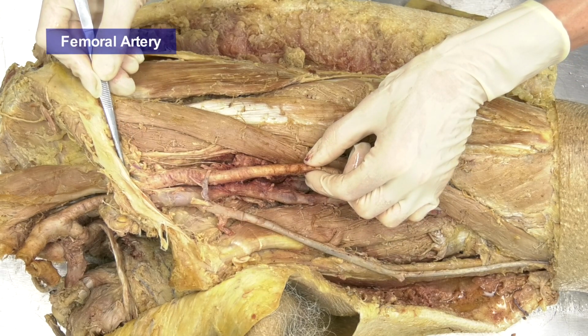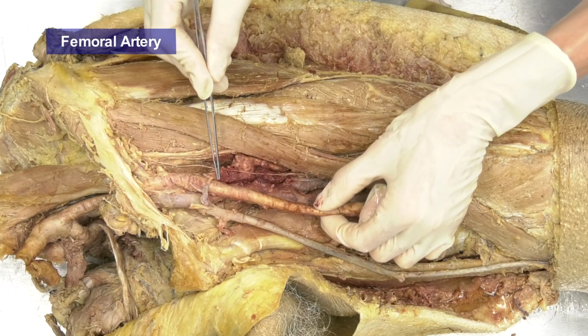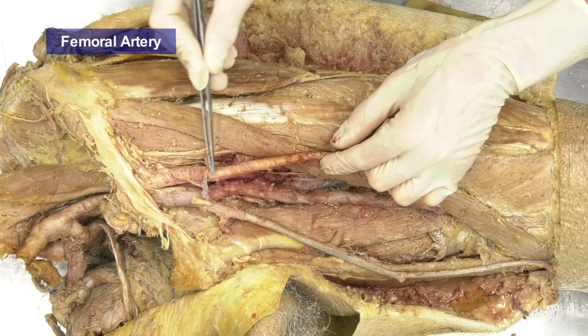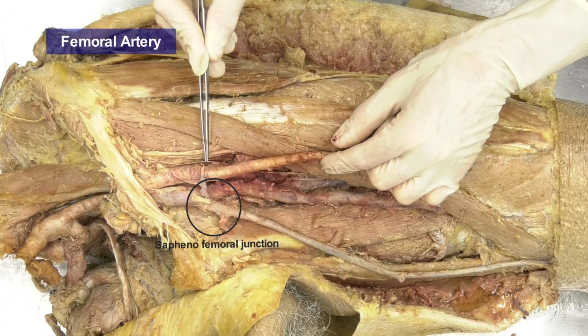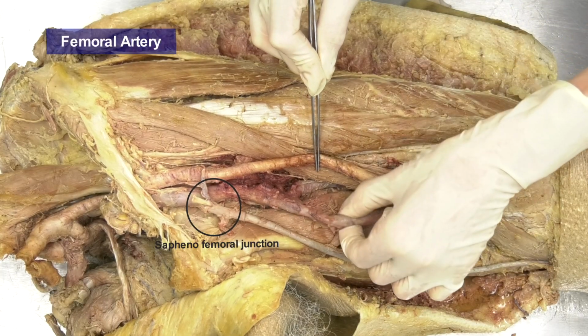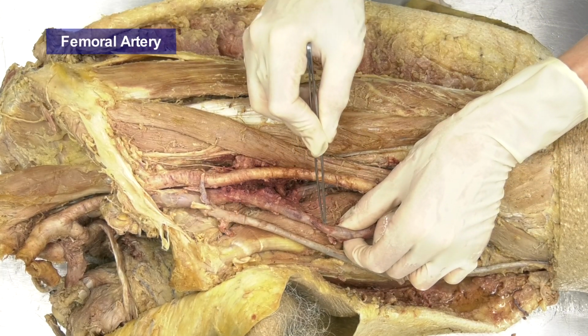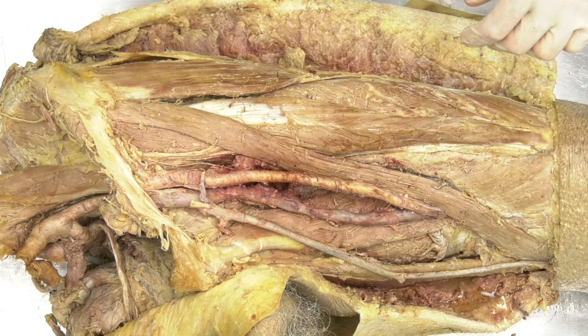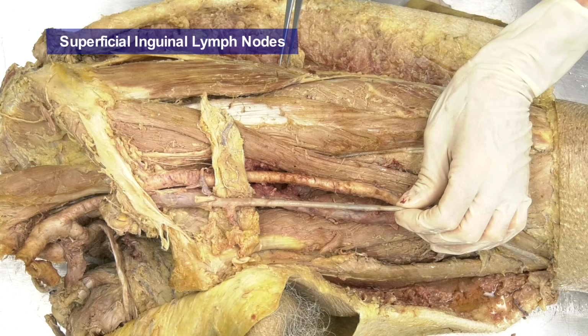It is very important to note that the bifurcation of the common femoral artery is approximately at the same level as the saphenofemoral junction, while the junction of deep femoral vein to the femoral vein is located distally. In the next step, we assess lymph nodes.